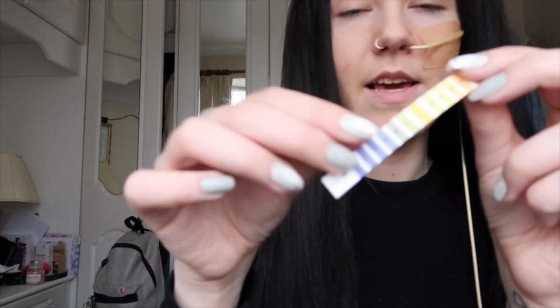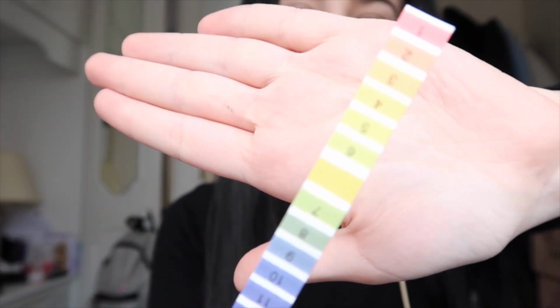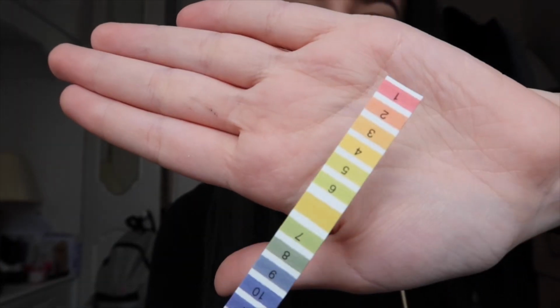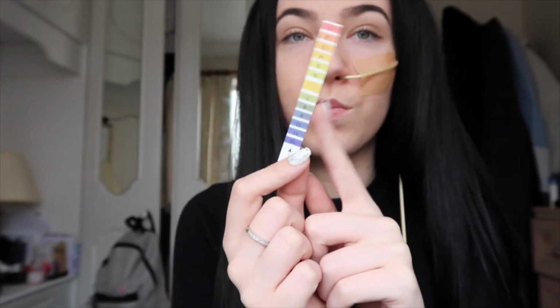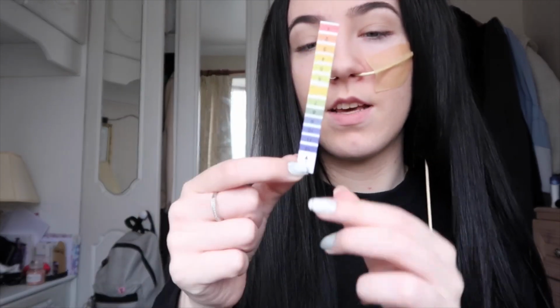And then you get given a pH strip, which is what I was talking about before, how you test the acidity of your stomach. You will have to use one of these to do that with. So if you are feeding with an NG tube, which is what I'm about to place, then you'll probably get given a container full of these. But you usually do get one included in your pack. So I'm going to pop that in the pack for a minute because we don't need it.